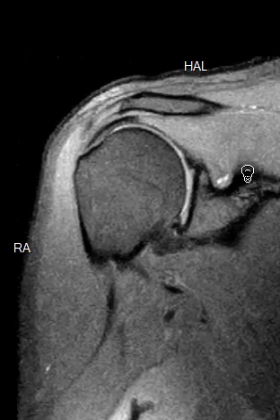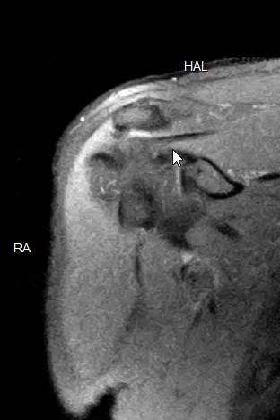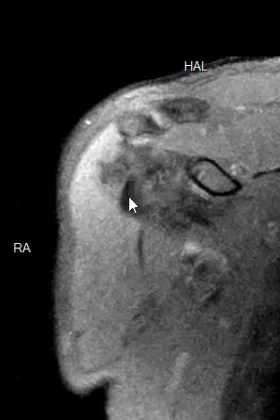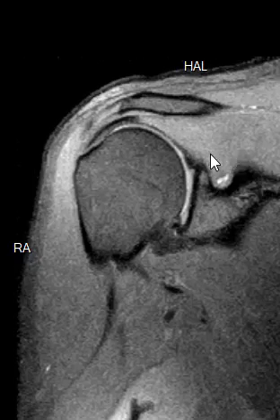You have some very minimal bursitis above the rotator cuff, but no rotator cuff tear — just a little bit of a bursal effusion that can cause some pain. Then we're going to come down to your biceps tendon. Your biceps tendon comes off the top, goes over the top, makes a turn, and comes down here. Your biceps tendon looks completely normal.